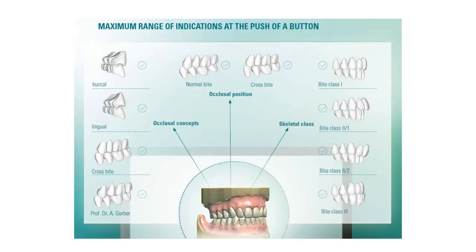The other thing we did with our tooth library is put in several different occlusal combinations. When you're doing your tooth setup, you can pick buccal, lingual, crossbite, or any combination. It will come in the software in perfect occlusion, which really saves a lot of time and energy when doing denture teeth setup, because you know it's going to function perfectly in whatever occlusal setup you chose.